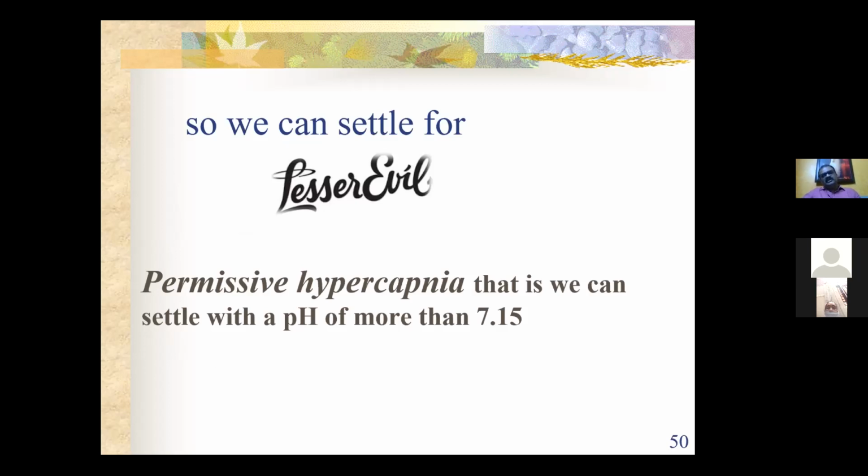There are a lot of other things like volutrauma, barotrauma, biotrauma, all those things. When you're using higher tidal volume, the lung can get injured by the tidal volume. Even when you're using a normal lung, like in an anesthesia case, an elective case, we're keeping a tidal volume of 10 ml per kilogram body weight. Even after 2 or 3 hours of anesthesia, the lung can get injured because of your high tidal volume. So even in anesthesia, you should be using only 6 to 8 ml per kilogram body weight.